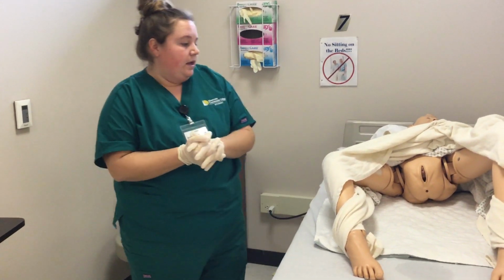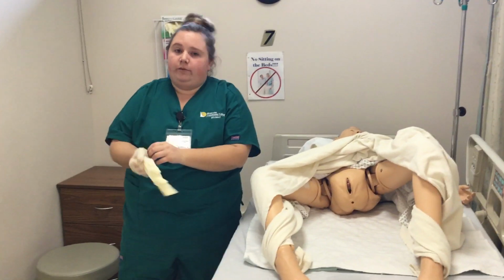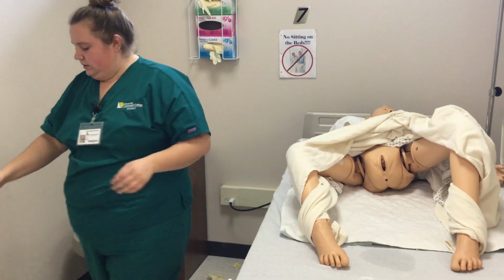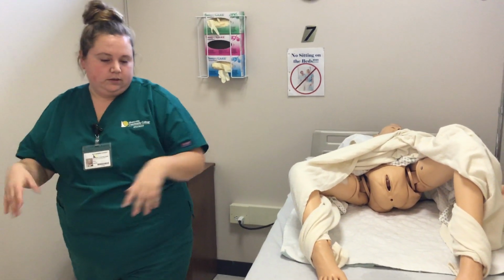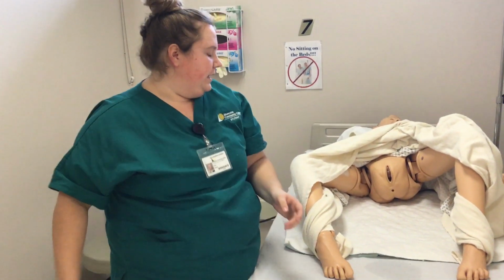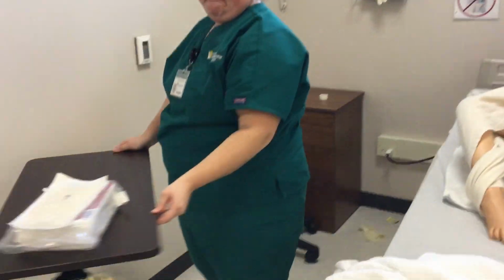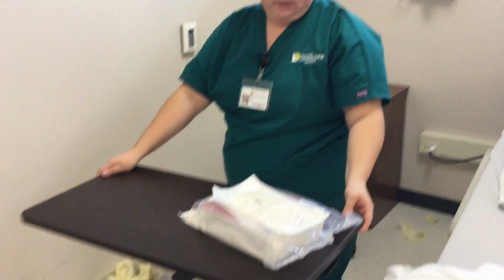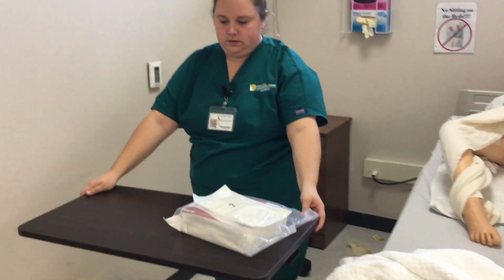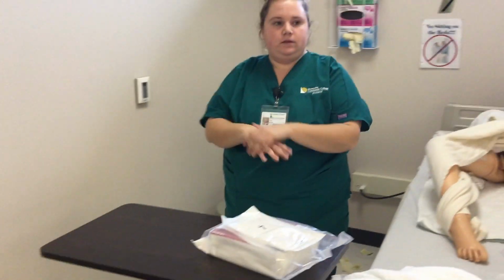And then I'm going to remove my gloves and perform hand hygiene. We want to also assess the patient's age and gender. At this time, I'm going to start opening my kit. Also you want to know the patient's comfort level. Then we're going to perform hand hygiene. We're going to put on gloves.